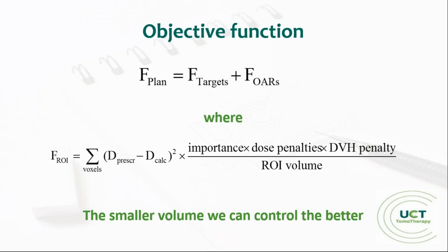Tomotherapy planning is always IMRT, and the objective function consists of 2 functions, one for target and one for organs at risk.